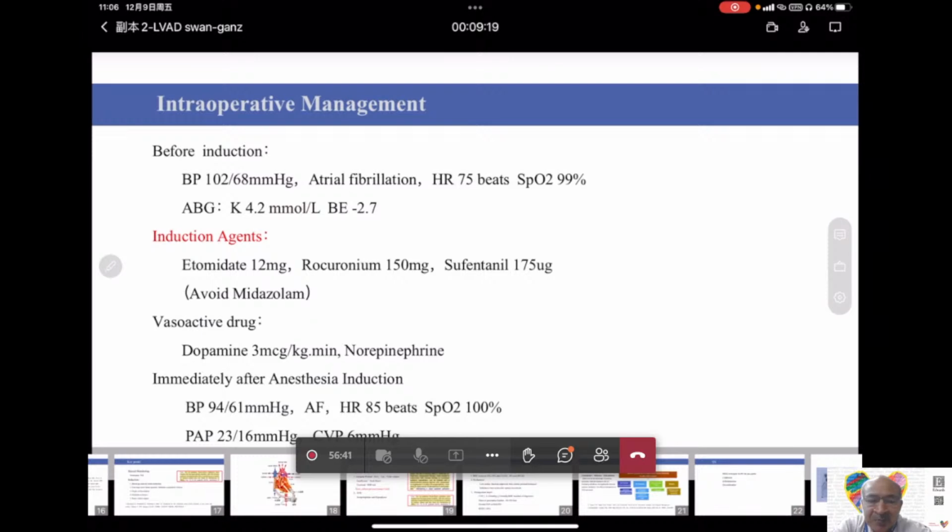The other was about my colleague's experience with LVAD. I just want to add a word of caution, because SvO2 is an indicator of volume, but we have to be careful. If oxygenation is not good because of any other lung reason, it will confound that SvO2. And on postoperative day 2 or day 3, if there is sepsis, this also tends to confound. So that needs to be carefully observed.